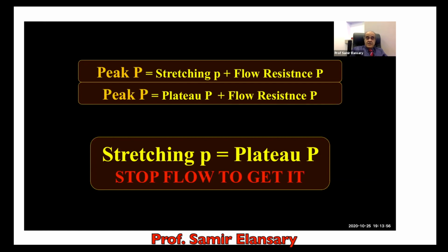Peak pressure equals stretching pressure plus flow resistance. Again, peak pressure equals, in other words, plateau pressure plus flow resistance. Stretching pressure will equal plateau pressure. Stop flow to get the plateau pressure.